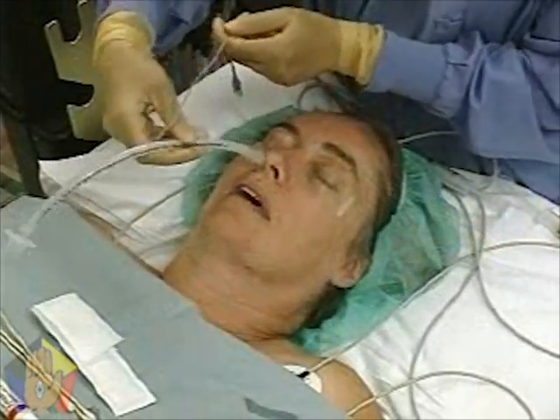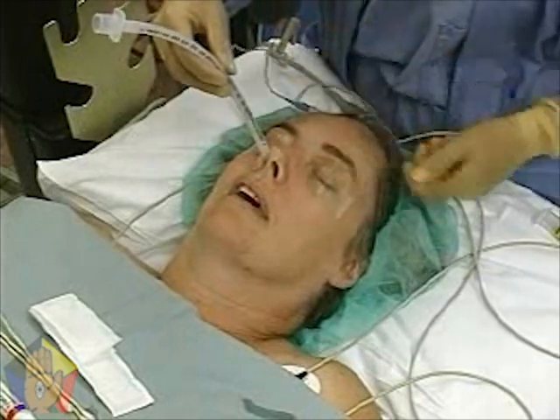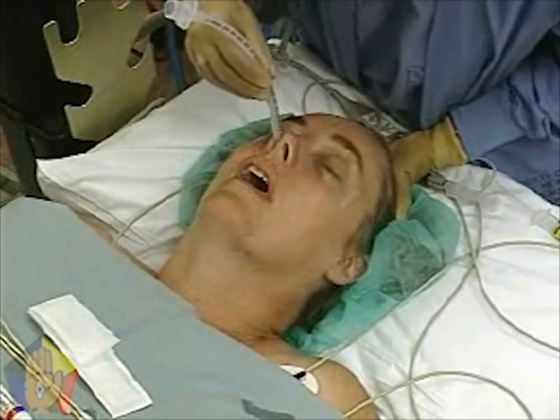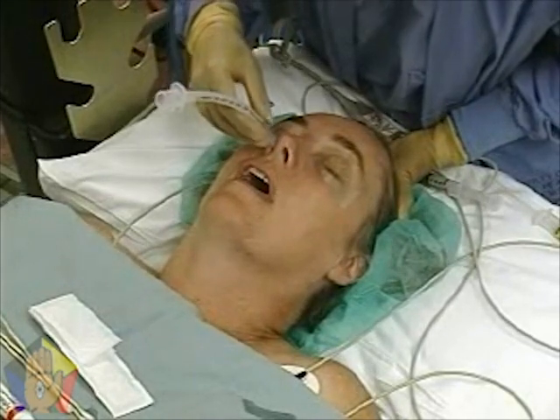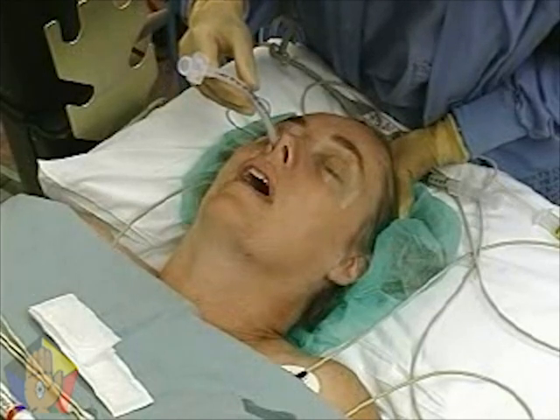Place the tube gently in the nose and advance it using the technique described for the nasal airway. Gently extend the neck if the tube is difficult to pass. Watch for signs of fogging or condensation in the tube as the tube approaches the vocal cords. The quality of the voice may also change.